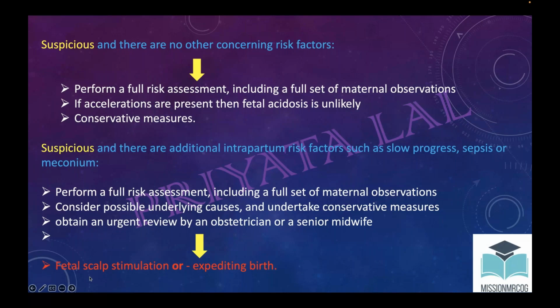Okay, so this was not there in the previous guideline. So this you have to remember: fetal scalp stimulation and expedition of birth if there is a suspicious trace and an intrapartum risk factor. So this is a change in the guideline.